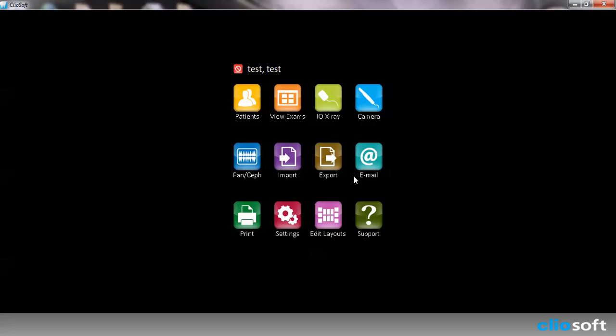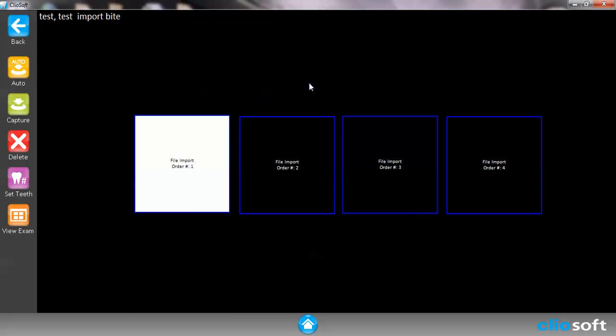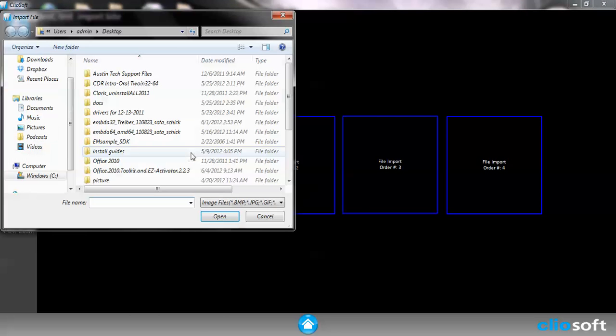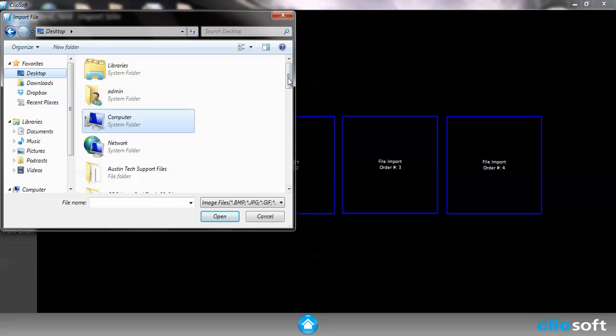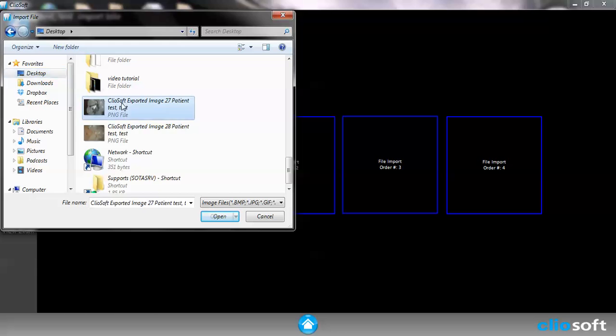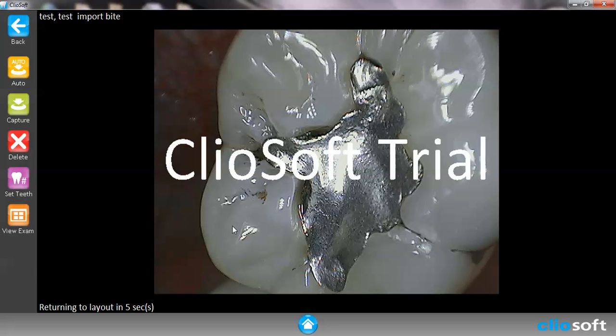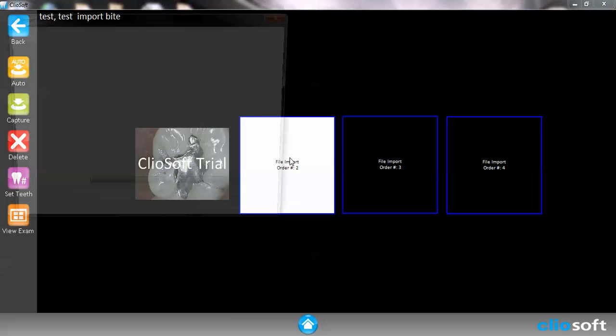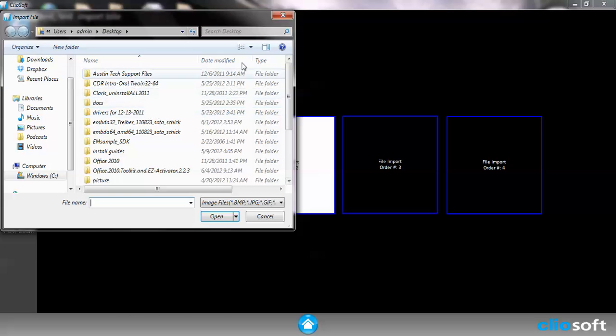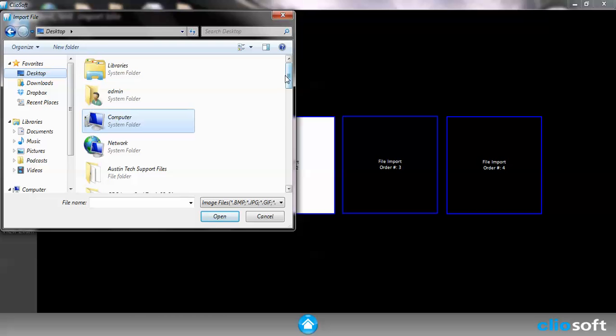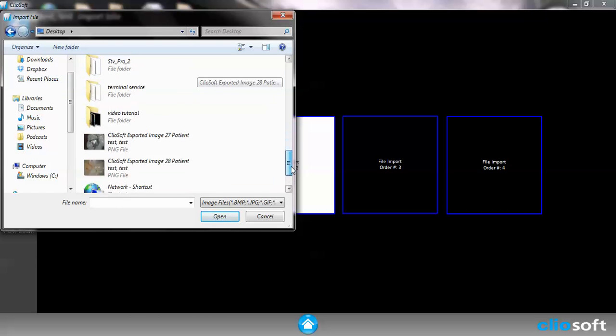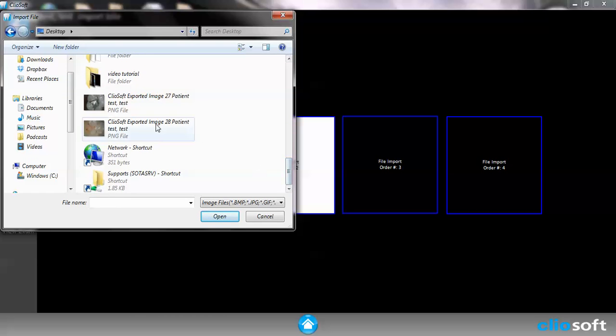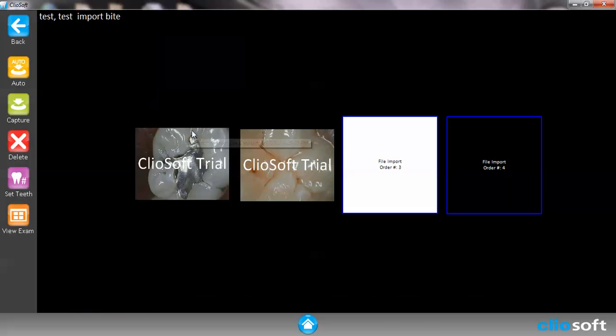Now if I hit the import option right here you're going to notice that I've created my own layout. These are some of the single ones that we have. Now if I choose this I can actually double click this and choose an image that I already have. For example, I saved some images onto my desktop. I'm going to go ahead and hit that. It's going to automatically put this image into my layout.